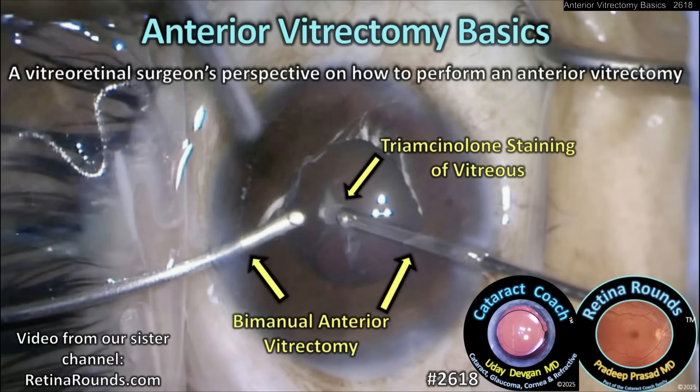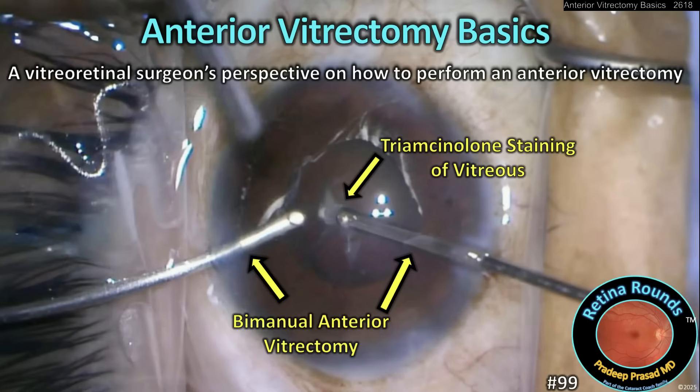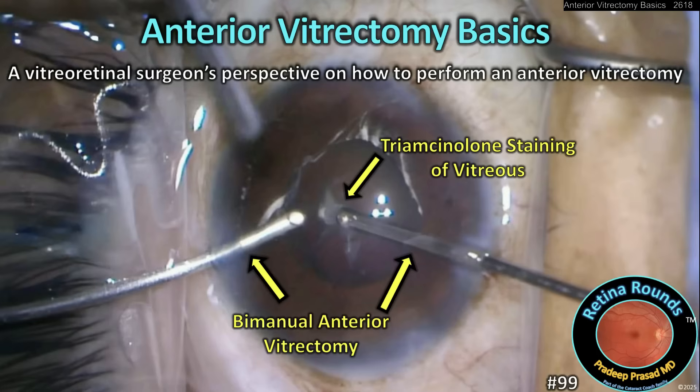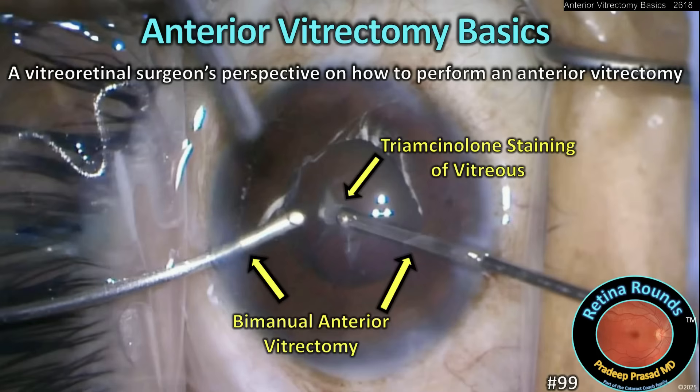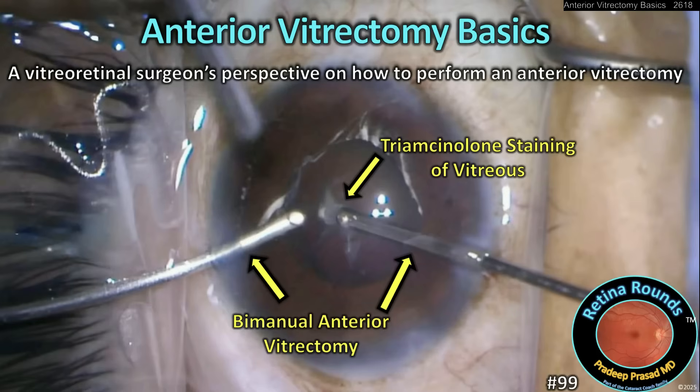CataractCoach.com presents anterior vitrectomy basics. A vitreo-retinal surgeon is going to teach you how to do a proper anterior vitrectomy, from sister channel RetinaRounds.com. Retina Rounds, episode number 99: anterior vitrectomy basics.